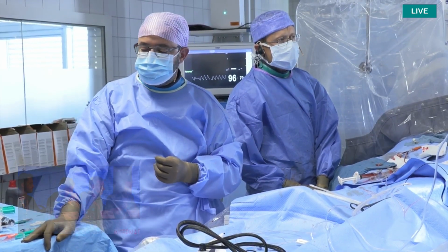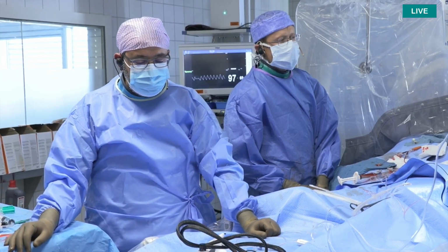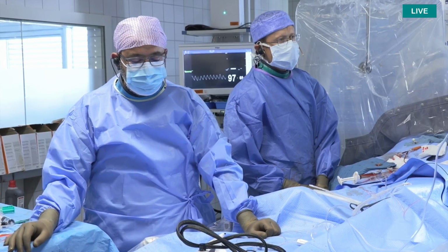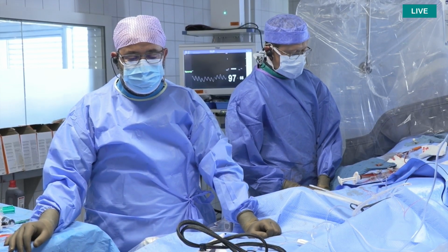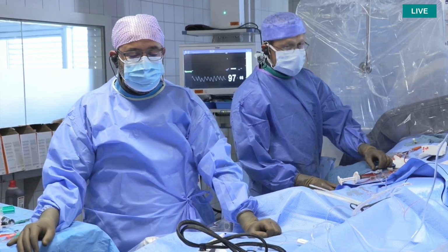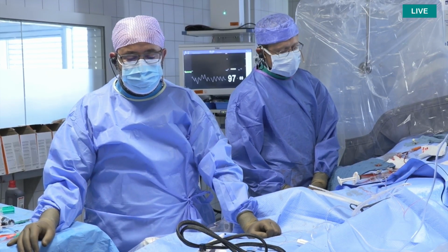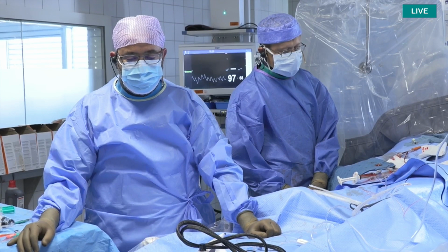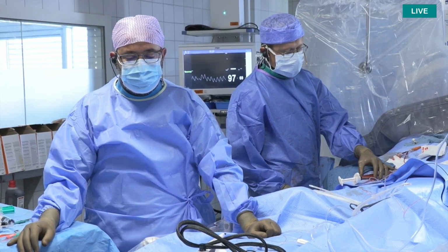Yeah, it's a very good question, Ole. And this has also been integrated in this document. So CT is a way to assess lesion calcification. The problem with CT, at least with the usual CTs we have in our hospitals, is that because of the blooming artifacts that calcification causes, it's difficult to quantify calcium accurately in the coronaries.